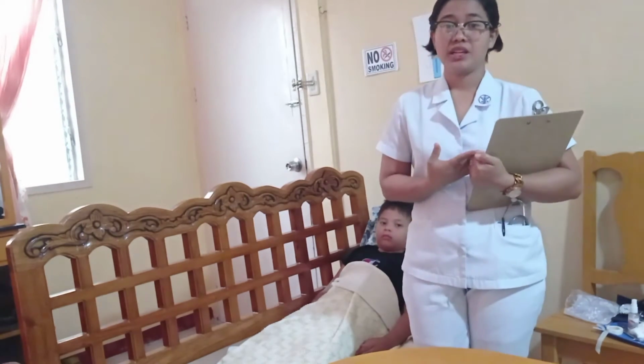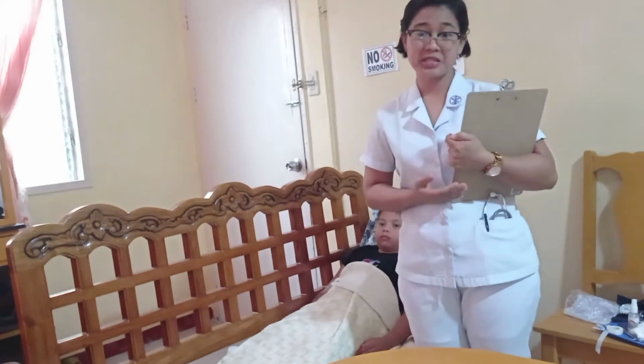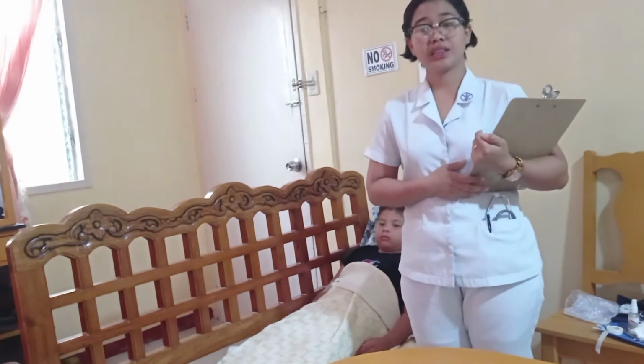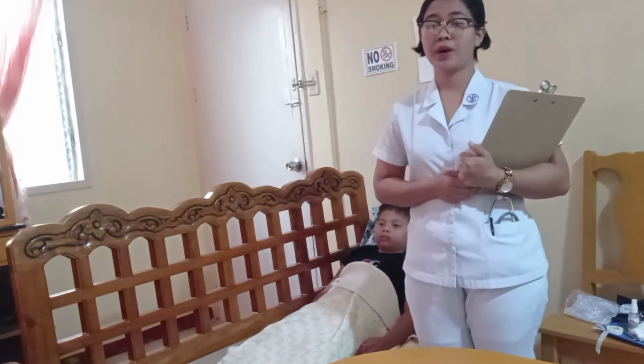Then, I am going to explain that oxygen is not dangerous when safety precautions are observed. It is so that the patient would be comfortable throughout the administration and the patient and significant others will be educated on the do's and don'ts while on oxygen therapy.